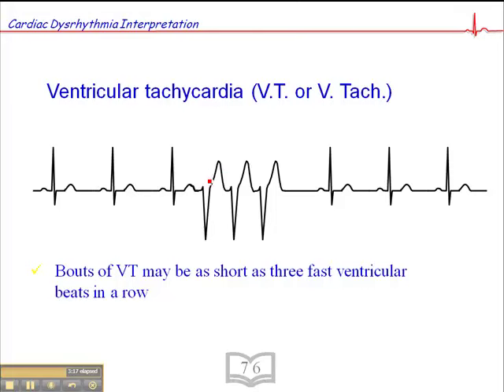The criteria for VTAC — short runs of VTAC — is simply three ventricular ectopic beats in a row. That would be a short run of VTAC. So if you see three ventricular complexes in a row at a rate of 100 or greater, that would be considered a short run of VTAC.